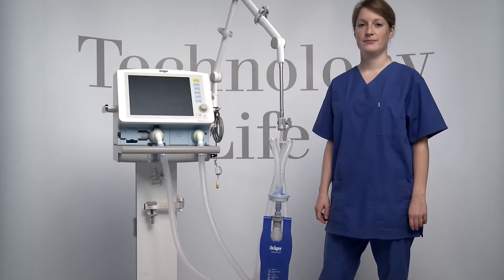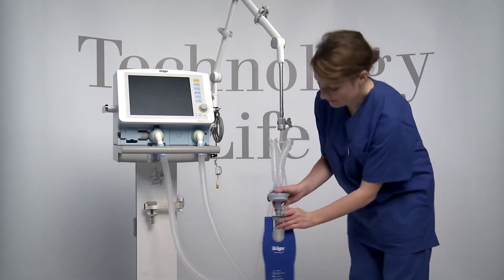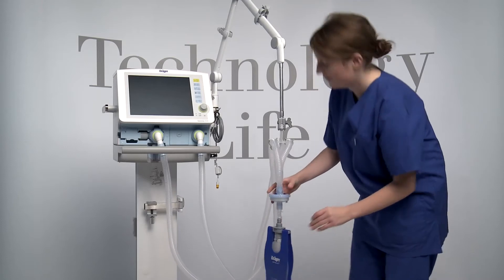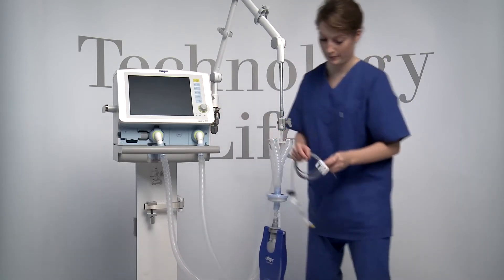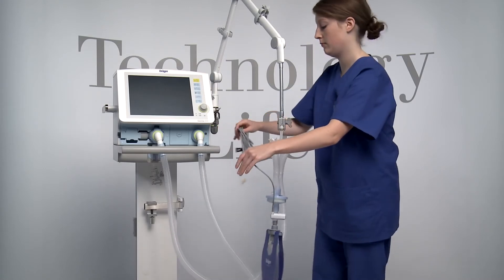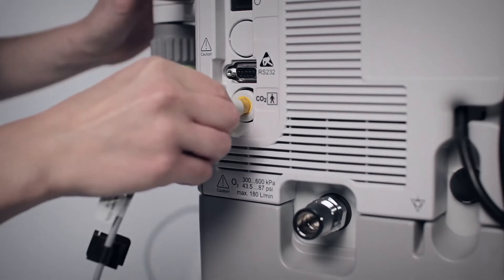The option CO2 offers the possibility of a CO2 mainstream measurement directly at the Y-piece and delivers measuring data in real time. They are shown as a graphic and as numerical values on the screen of the ventilator. Insert the cuvette into the patient connector of the Y-piece so that the cuvette windows are facing to the side. Afterwards, push the CO2 sensor onto the cuvette, with the cable facing towards the device.